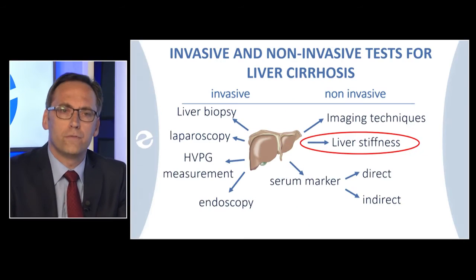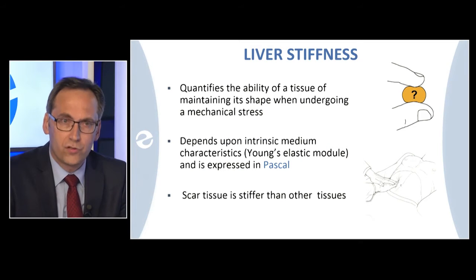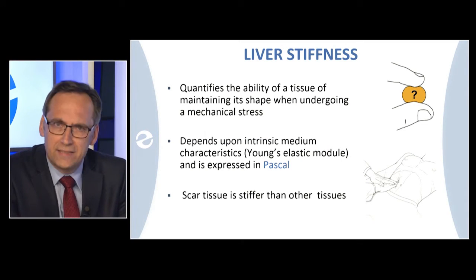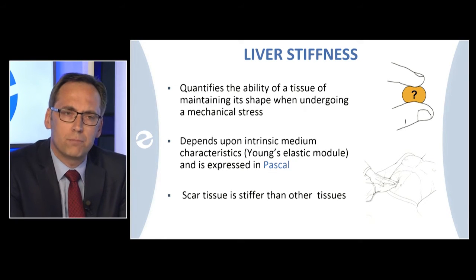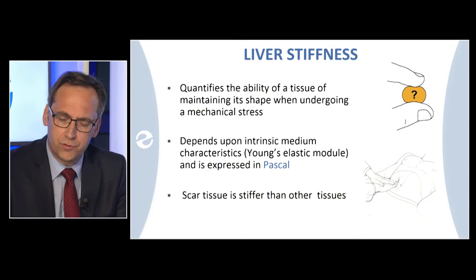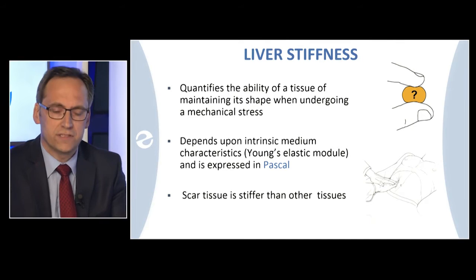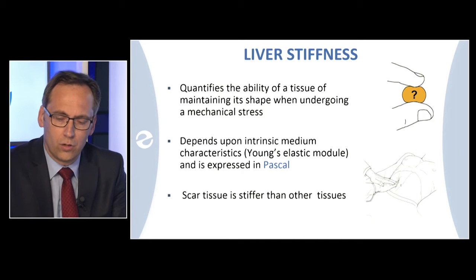Now, I learned from Mark that most of the participants today are already familiar with the FibroScan and elastographic techniques. So I will briefly go through the basics of the technology. I will then share with you some of our and published data on the basis of liver stiffness. And we then will have time to really go into the algorithms, how to really make the diagnosis using the device in alcoholics or in patients that drink alcohol.